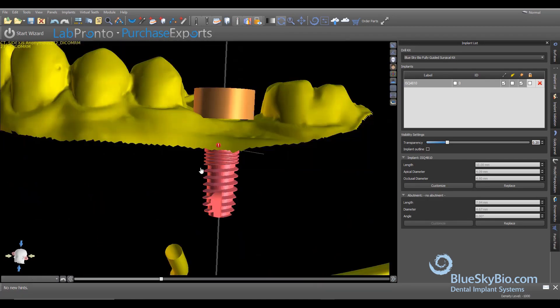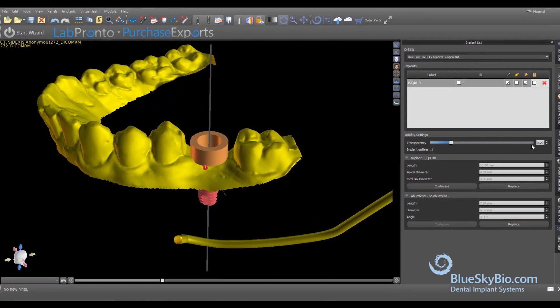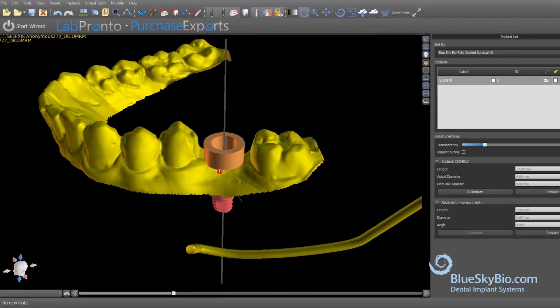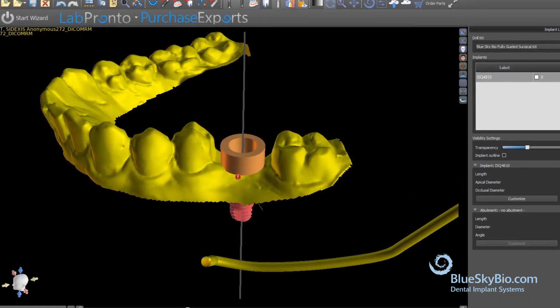The guide hole, represented by the gold cylinder in the software, has the appropriate inner diameter to accept the metal guide sleeve and is automatically positioned to guide the drill to the correct position and depth. This ensures that the drills will create the proper diameter and depth for the planned implant.